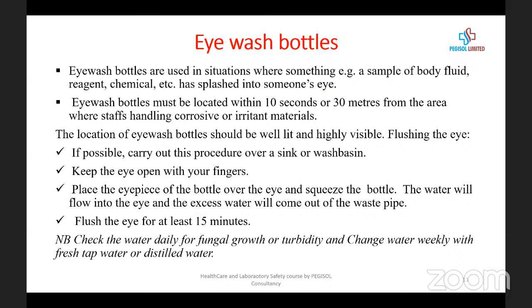Then keep the eye open with your fingers. Place the eye piece of the bottle over the eye and squeeze the bottle. The water will flow into the eye and excess water will come out of the waste pipe. Flush the eye for at least 15 minutes.